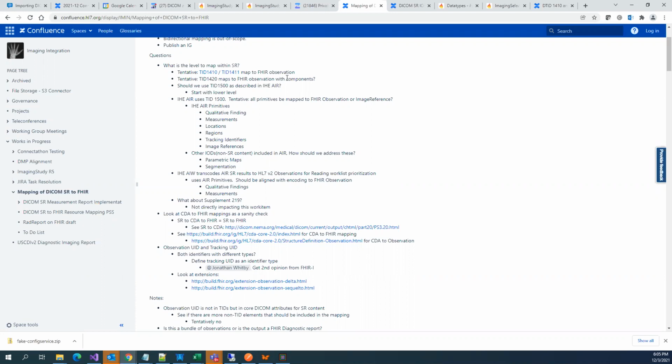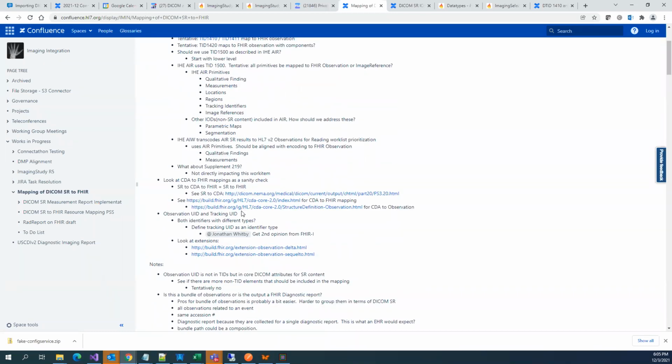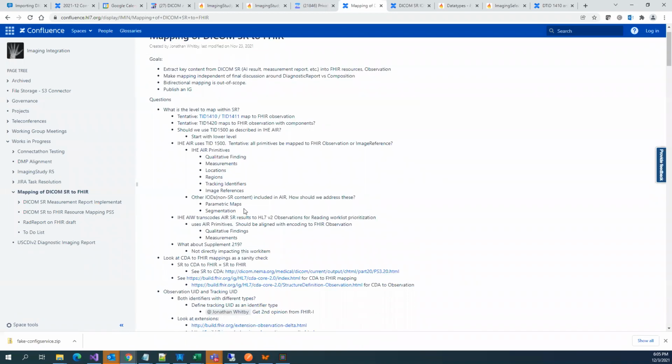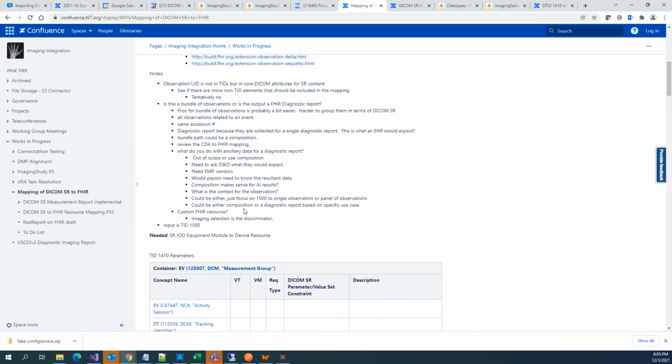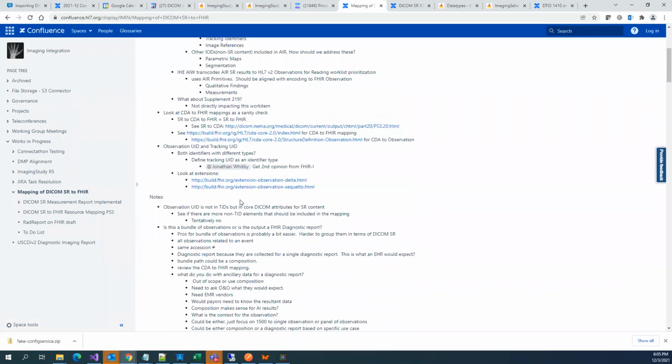If you look at the IG, they wanted to do that, but I don't see them working on that mapping yet. On the mapping, you mean any code related mapping? That was not their intention. They're mainly focusing on creating this implementation guide so that anybody can implement it, and we are already ahead, taking it in a draft state and implementing it.